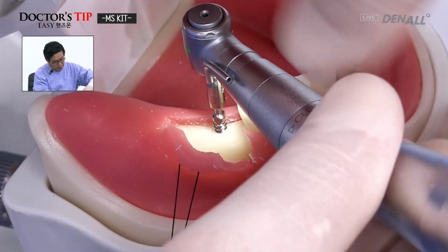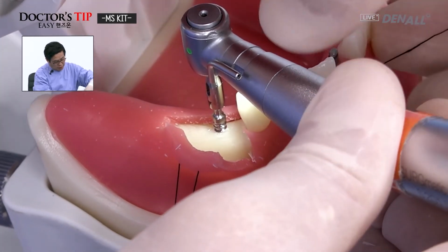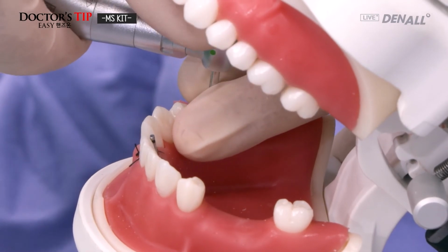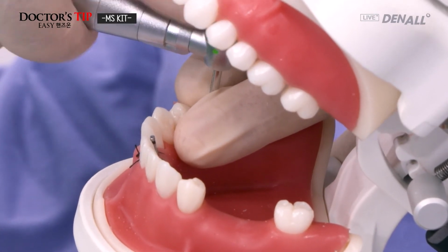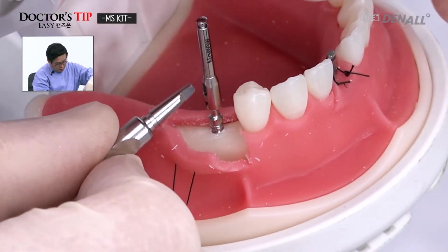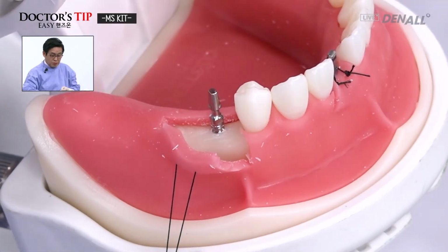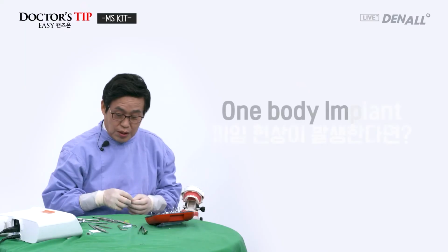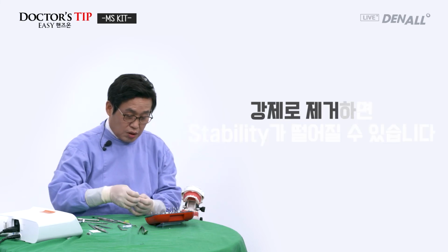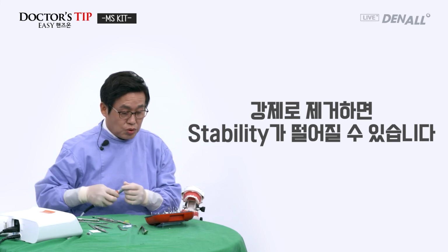And again, here also, excessive torque results in not being able to separate, so removing the handpiece is easier. You remove the handpiece using the separator, push it in, and then you can easily separate the two. Again, because it's a one body implant, if there is jamming and you force it out, you will lose stability. So you have to be careful.